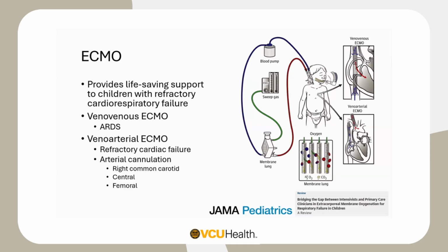Where you put the device, where the arterial inflow goes, can have implications in terms of perfusion as well as autoregulation and hemodynamics, which we'll talk about.